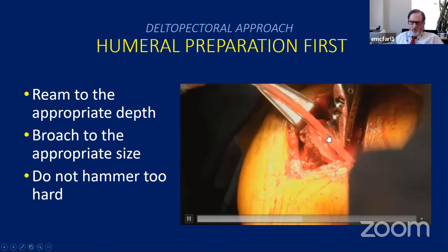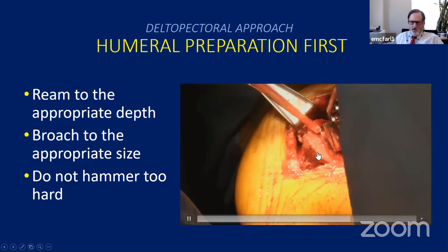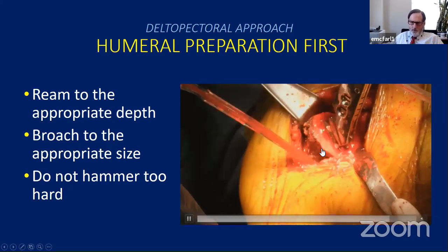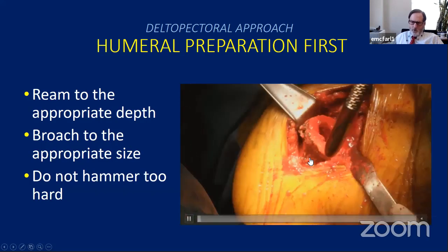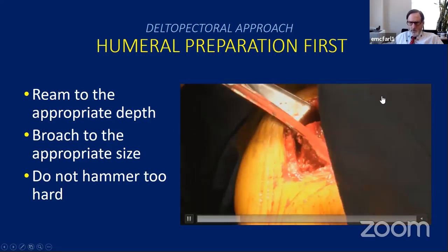The other thing is there are people that report fracturing the proximal humerus. And again, you just have to be gentle. A humerus is not a femur. A lot of times the fellows want to just hammer away, and if you do, that's when you're going to break the humerus. So I like to press fit the humerus distally. Again, it's just an individual preference.